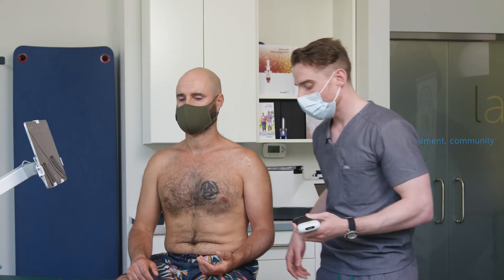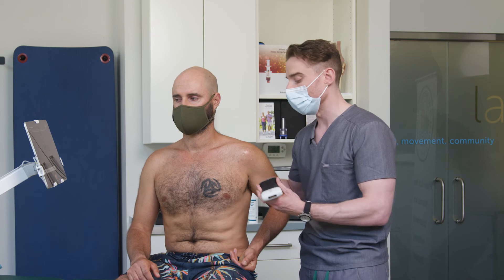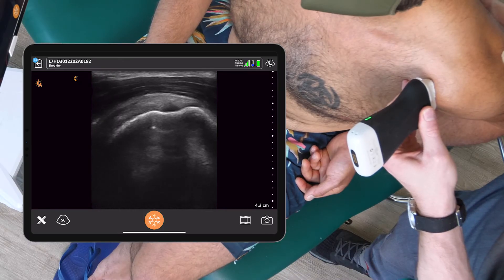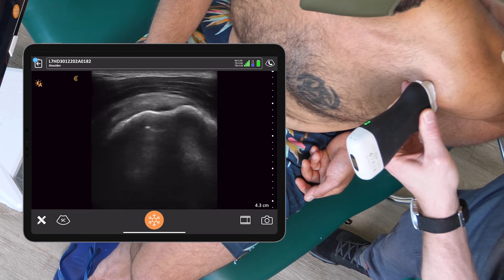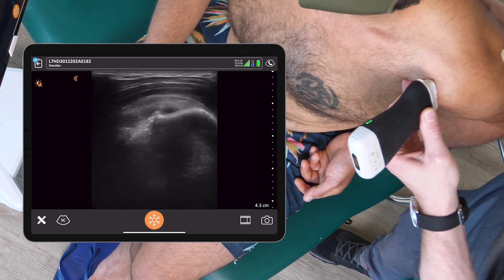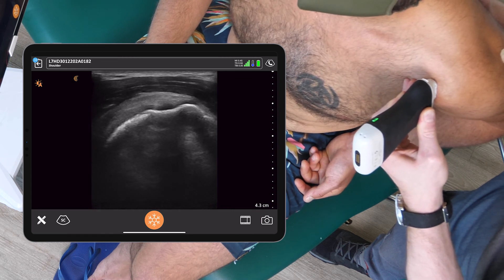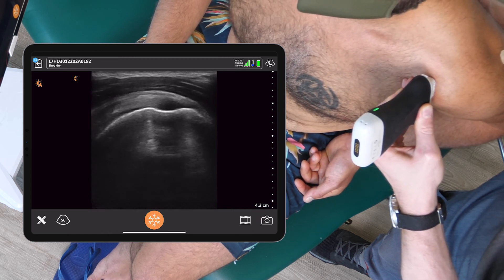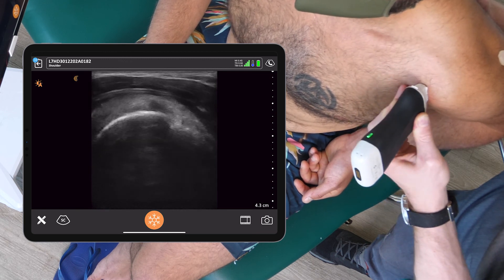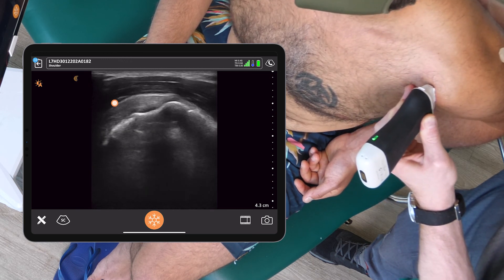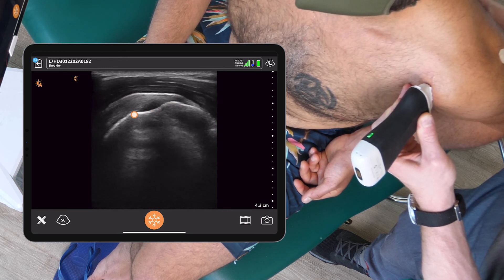Now we're going to ask Jaden to go to position two, and we're going to look at the supraspinatus. When we're appreciating the tendons of the rotator cuff, we're thinking about four major things: tendon thickness, calcification, neovascularization, and fibrillar disruption. In Jaden's case, I see no problems with the supraspinatus, as the tapering of the tendon on the lateral aspect of the humerus conforms quite nicely.